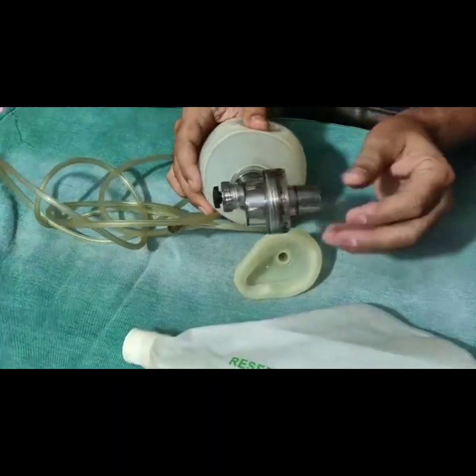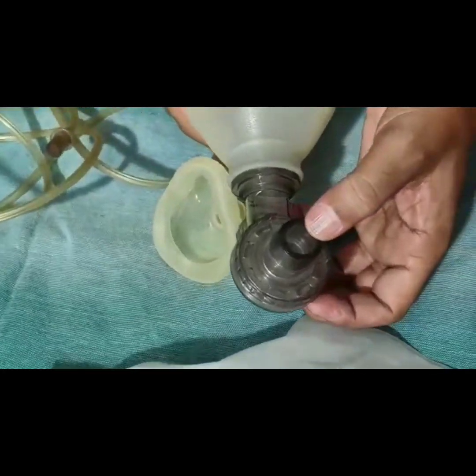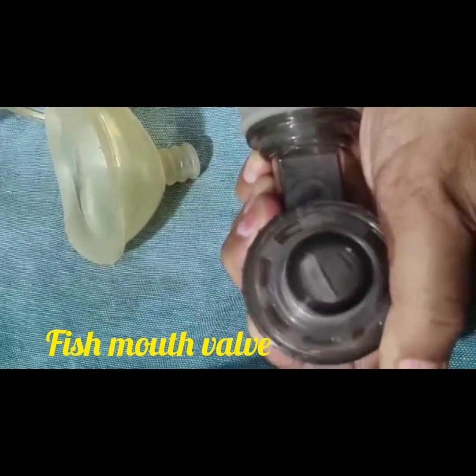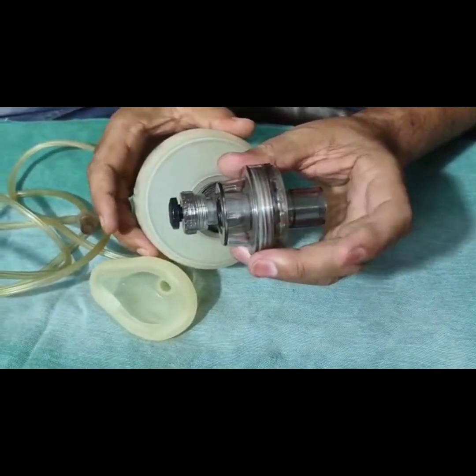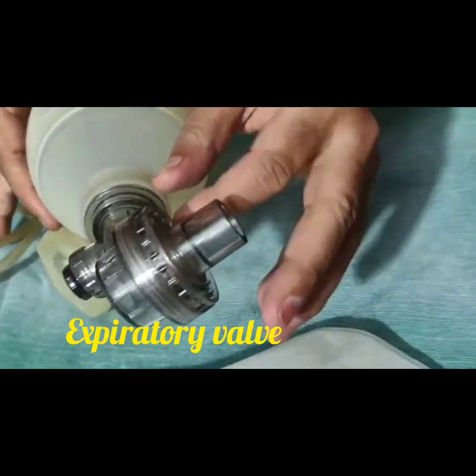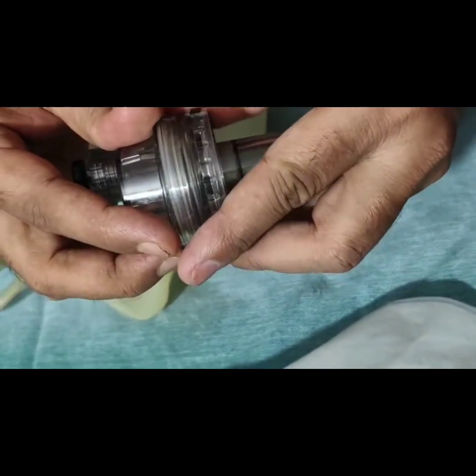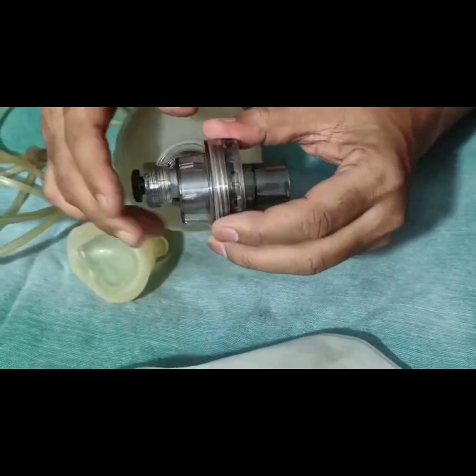This part is called the outlet. This outlet contains a valve inside which is also called the fish mouth valve. Once we press, the valve opens — it allows unidirectional flow of oxygen through it. This part is called the valve assembly, and the valve here is called the expiratory valve, which can be detached. The expiratory valve helps the exhaled air come out from the baby's mouth and nose.